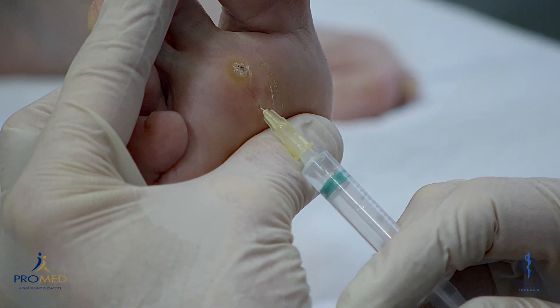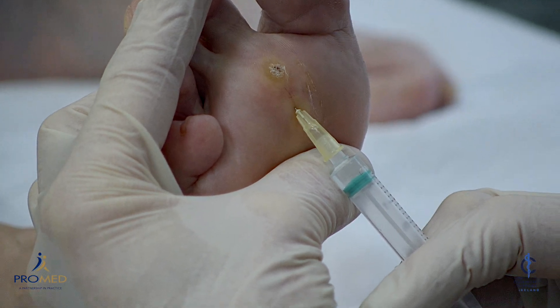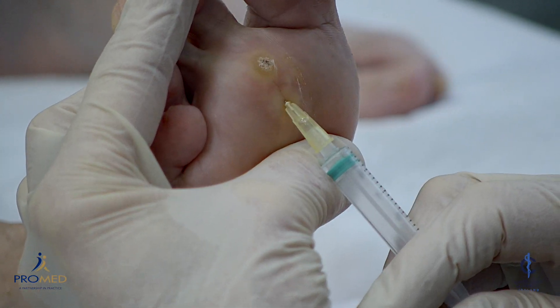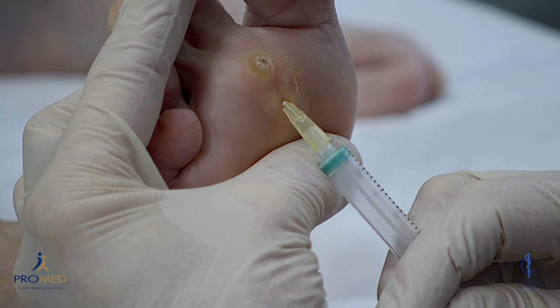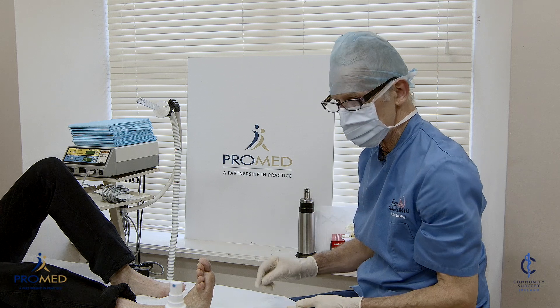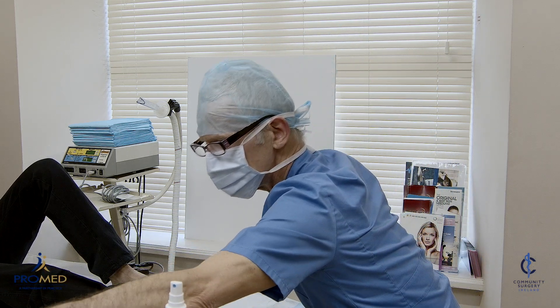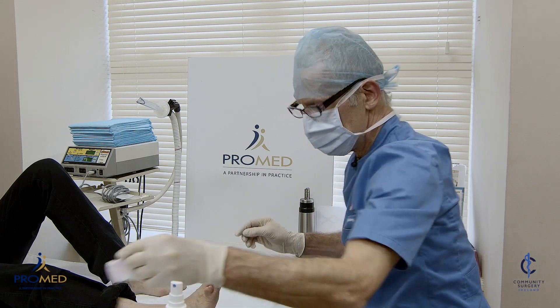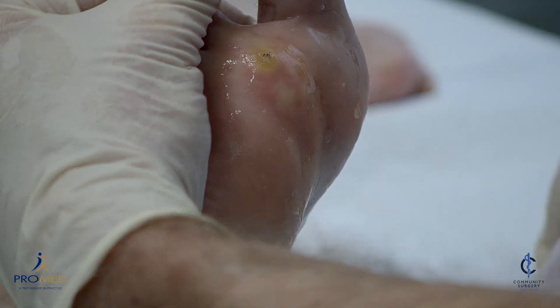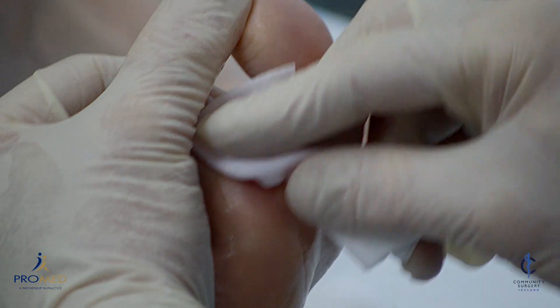Just a bit more anesthetic. Let me do a sharp spin there, please. So now we leave that for a minute or two to go numb and we just clean the skin again. There are different ways of treating plantar warts. Obviously doing nothing is an option, but Pauline's tried that and it hasn't gone away.